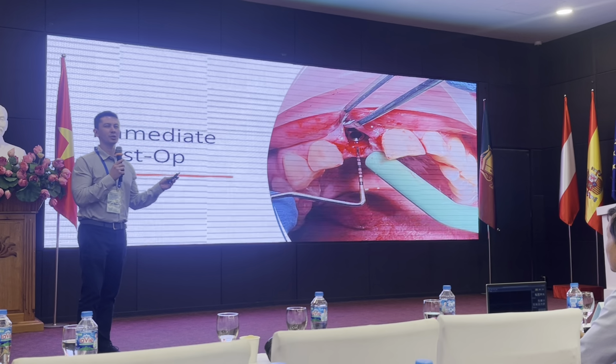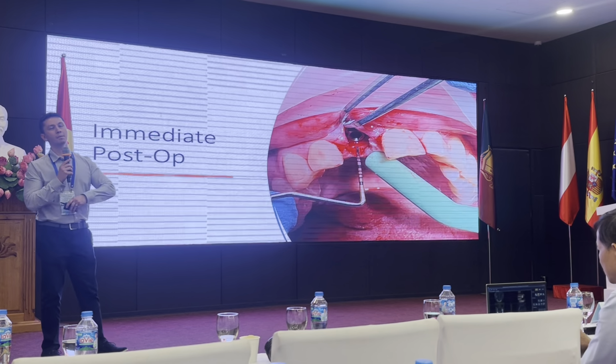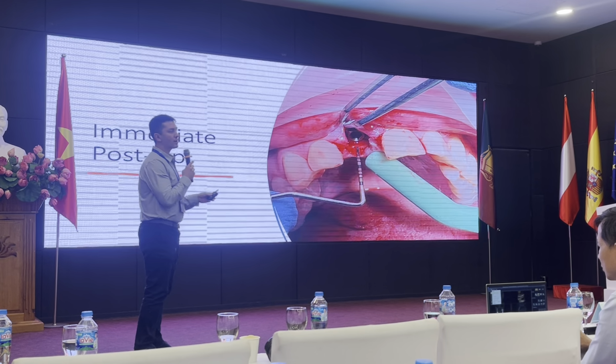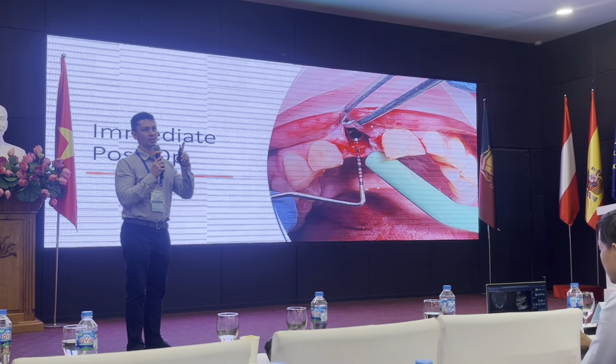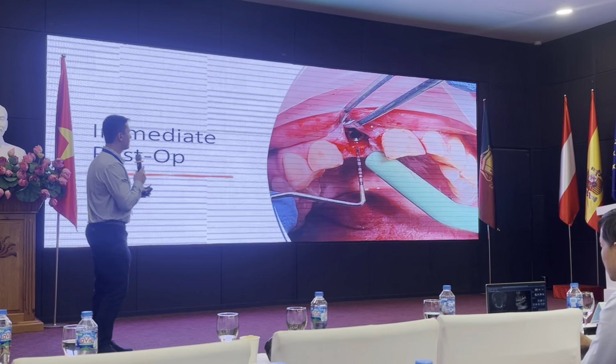Now the implant's kind of loose. All this back and forth. We take out the implant, put it back in, take it out. You guys ever hear the saying, measure twice, cut once? So plan, plan, plan makes for an accurate procedure.